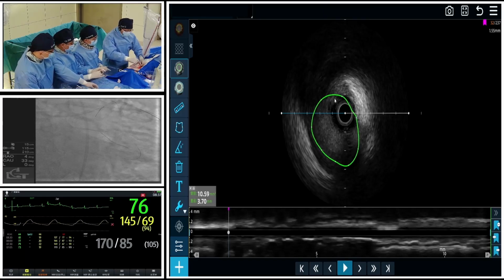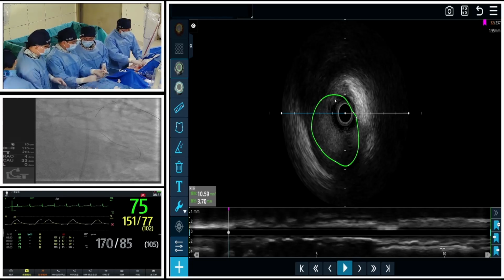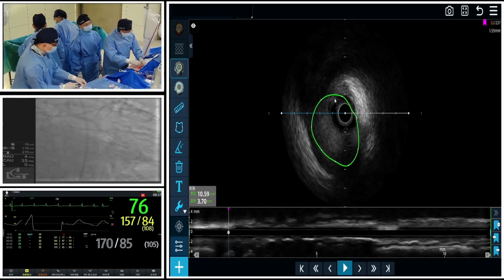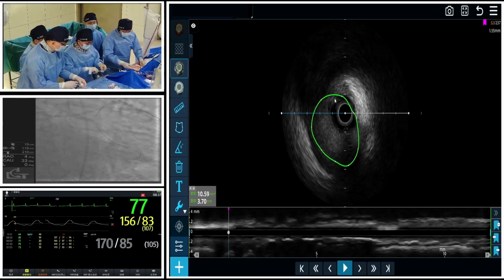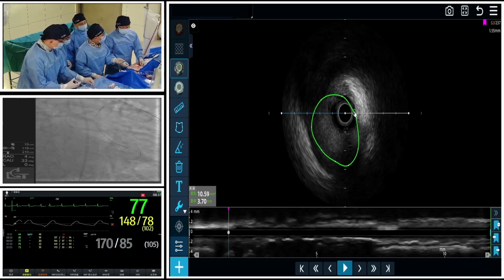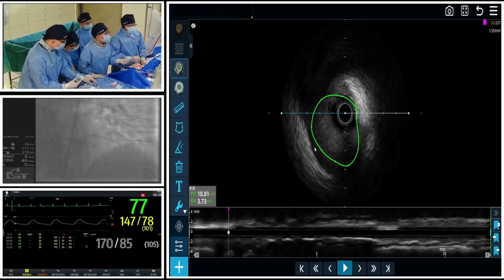of the circ. So certainly, I think for this case, we prefer a one-stent strategy. Yes, and also we can see that at the ostium of the circ, the lumen area is over 10 square millimeters. So we do not worry too much currently about the two-stent strategy. Like Professor Lee introduced, we are highly likely to perform a one-stent strategy with a provisional approach.